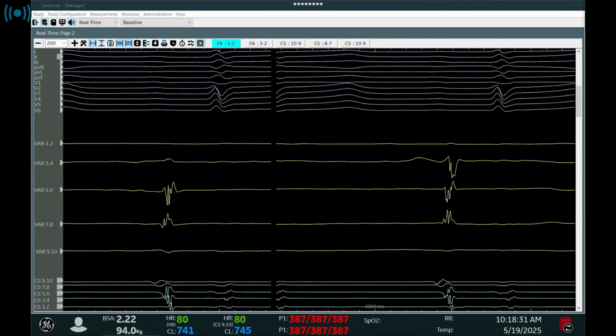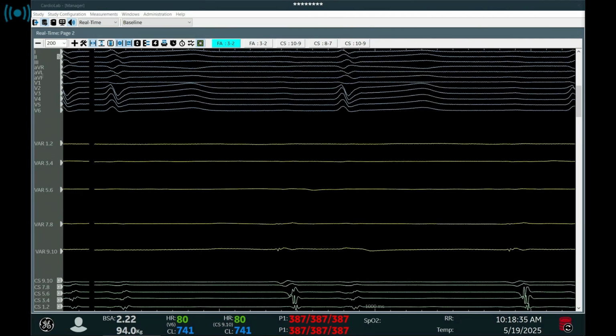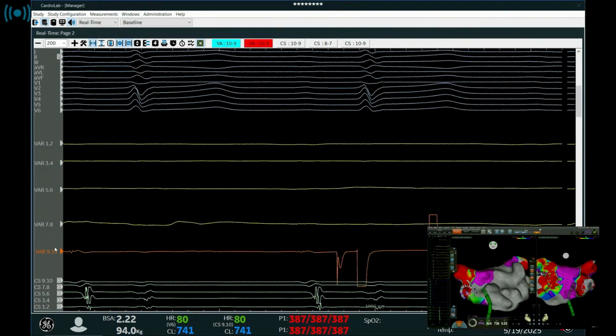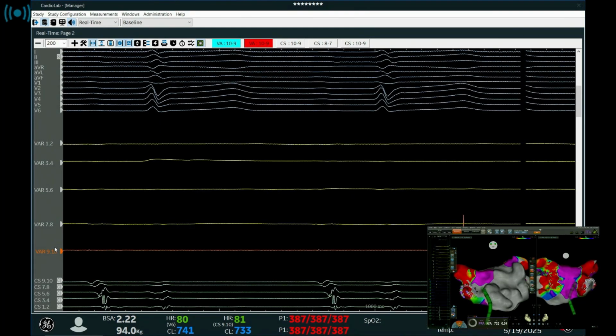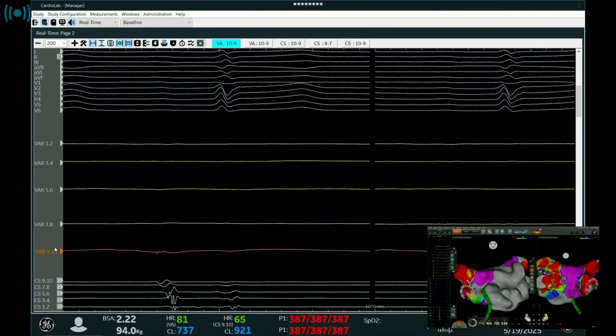Now I go to the right inferior, sorry. And we are in the right inferior and I have, can we pace from 9-10 please? No capture. No, it is on the bottom. It's okay, it is a bottom far field. Okay, perfect. I finished, Joseph. Do you want something else?